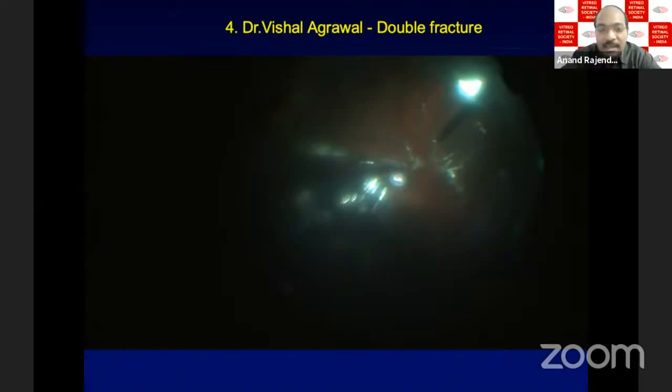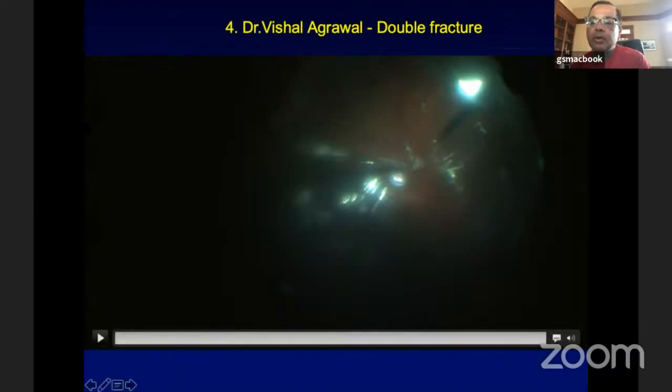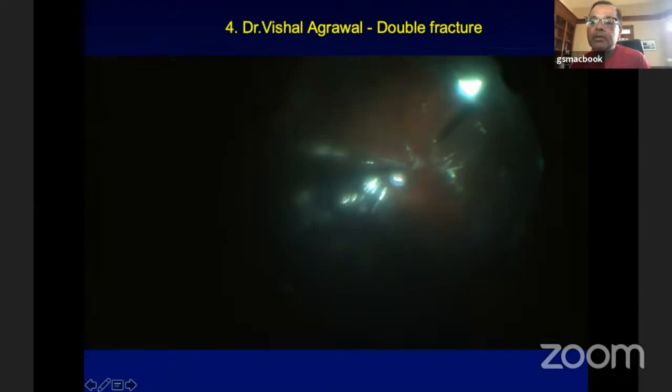Great job, Vishal. I just wanted to make one comment. Please do. Sure. When people are taking out anything from the eye, whether it's this as a foreign body or anything else, for people just starting, I know all of these guys are experienced, always make your incision on the outside about 25% bigger than you think, because what happens is when you bring it up to your sclerotomy sites, you don't want it to get stuck.